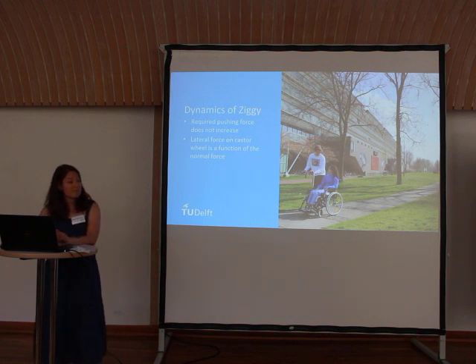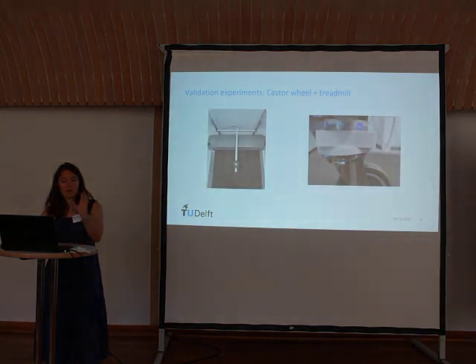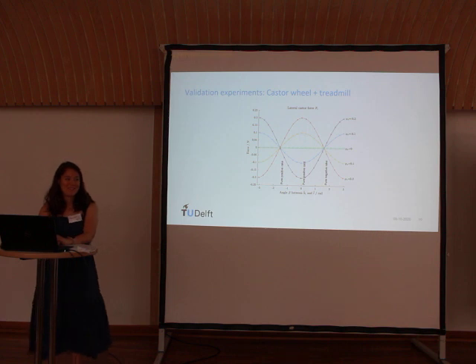Doesn't this device make it harder to turn? We also tested that by doing these rotations in pure cant, pure rake. It was difficult to test in this scenario because we had a small treadmill that was going forward at a fixed speed, but that is something that we want to consider. I think in the simulation we find that if you account for lots of assumptions and small angles, it does not necessarily make it that much harder. It's just like the vaguest statement I can make about this.